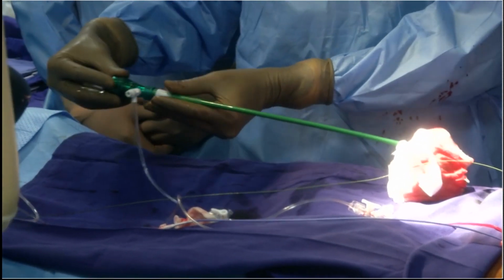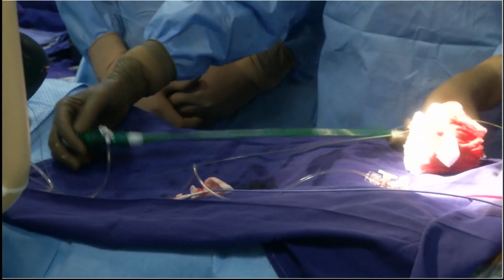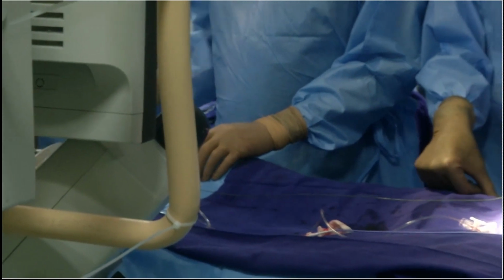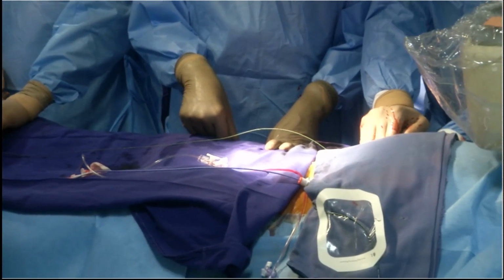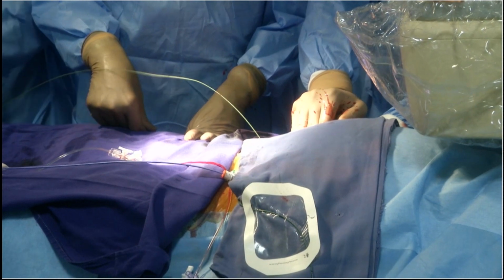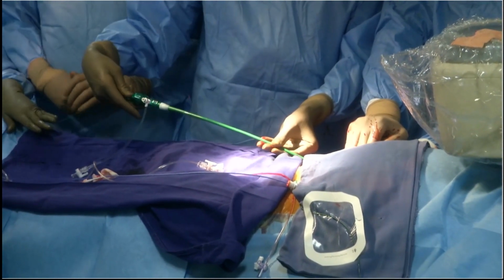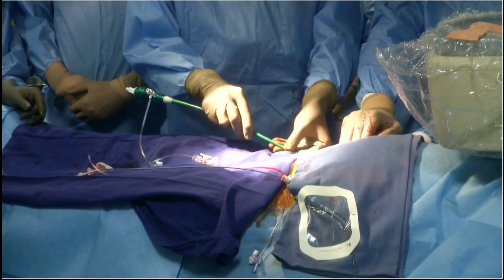And the valve systems are nicely done so that there is no leak. Okay, Sengo, if the patient has the oozing, please put your sheath. One of the most important aspects is after the 8 French or 7 French, whatever you use initially for the ProGlide deployment, the next steps of going up with the dilator and getting to the sheath are always on a stiff wire, an Amplatz wire, which allows you to put these things in safely.